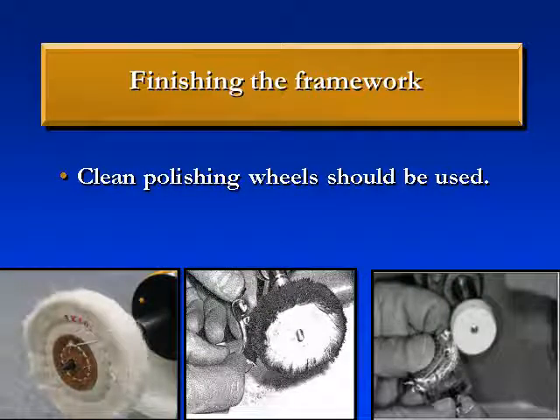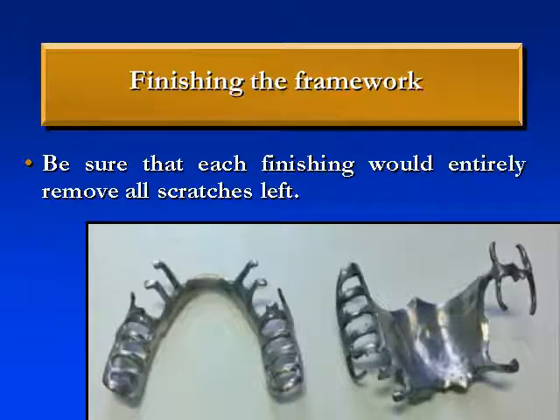After that, we start with polishing. Clean polishing wheels should be used for the purpose of polishing the metal framework. After that, we should be totally sure that finishing and polishing have entirely removed all the scratches and all unacceptable metal flashes remaining in the metal framework.